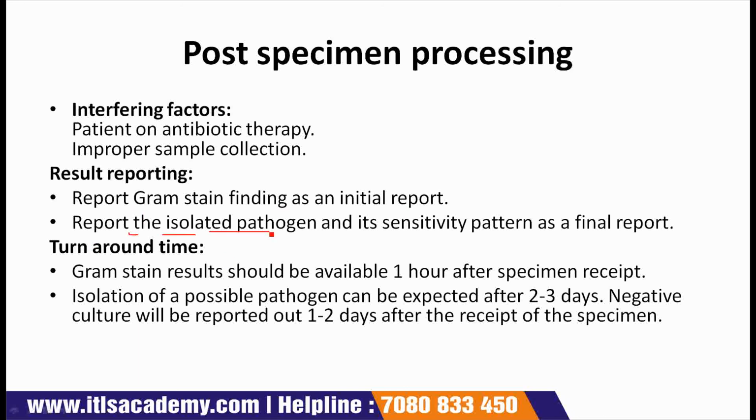Report the isolated pathogen and its sensitivity pattern as a final report. The laboratory will run a number of tests to determine if the growth is a bacterium, a virus, or a fungus. Remember that some bacteria grow naturally in your airways without causing illness. The laboratory will determine which of the bacteria makes you sick and which keeps you well.